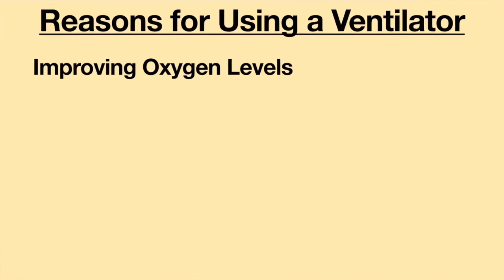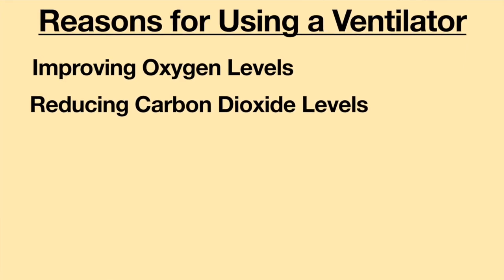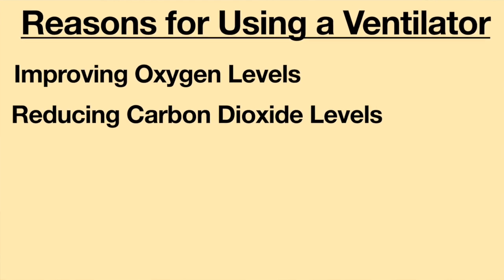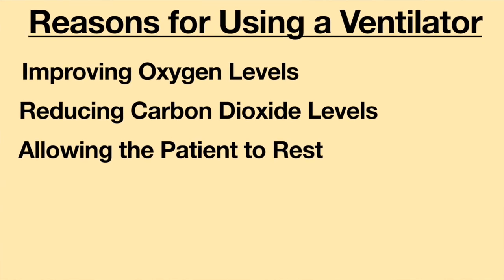Ventilators are a form of life support, and they may be necessary for a number of reasons, including improving oxygen levels. Mechanical ventilation can allow for higher concentrations of oxygen to be delivered directly into the lungs. Reducing carbon dioxide levels. If carbon dioxide is building up in the patient's body, ventilation may help get rid of the excess carbon dioxide.